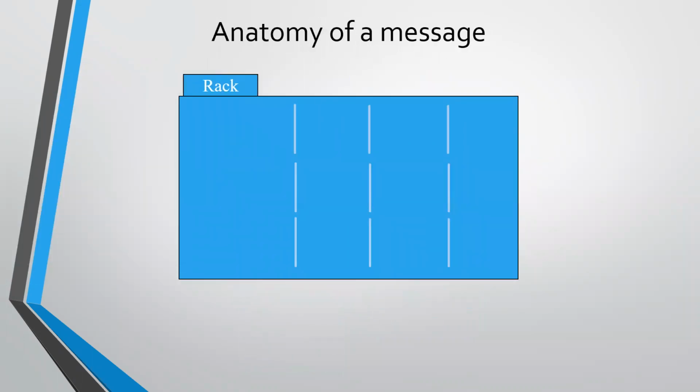Now that we know the principle of HL7, let us look at the HL7 messaging structure. We will look at the structure and conclude today's session here, maybe another 10 more minutes. Please bear with me.